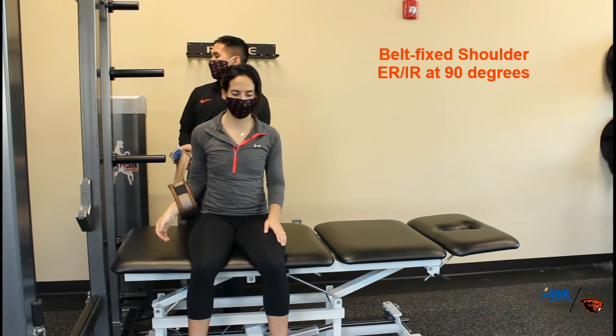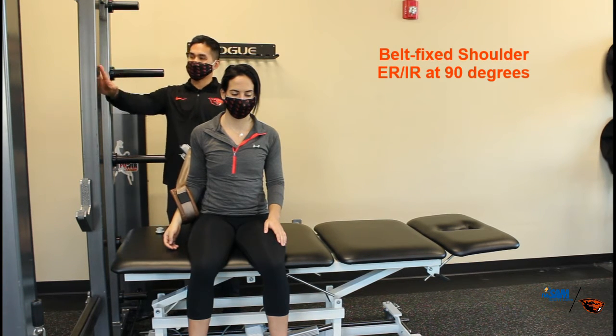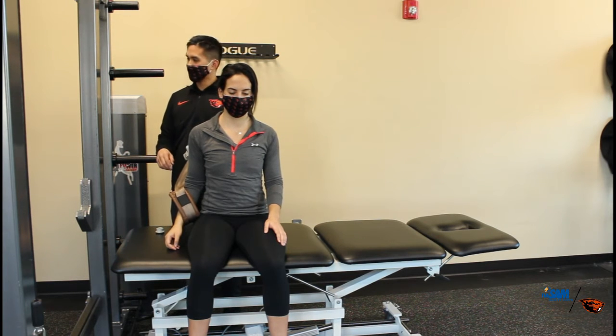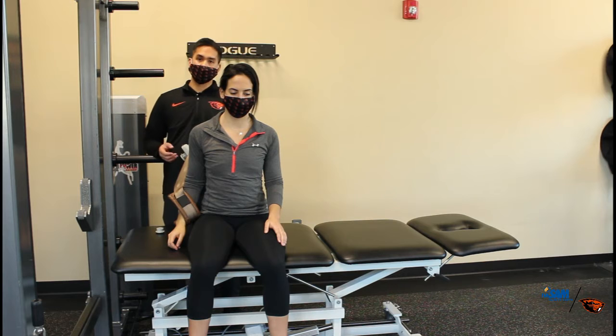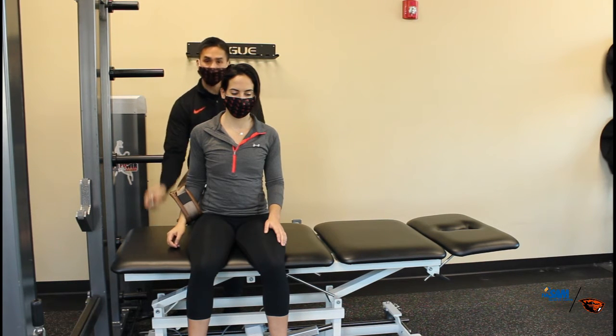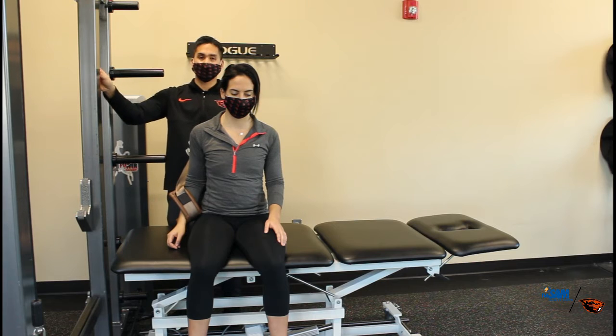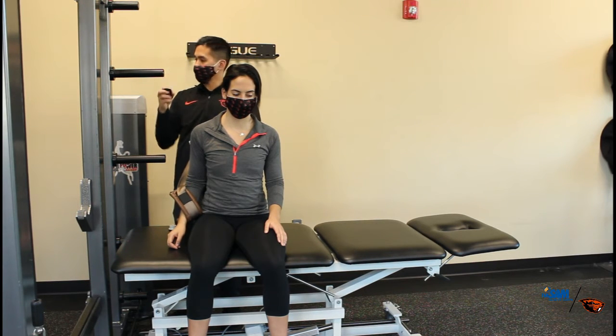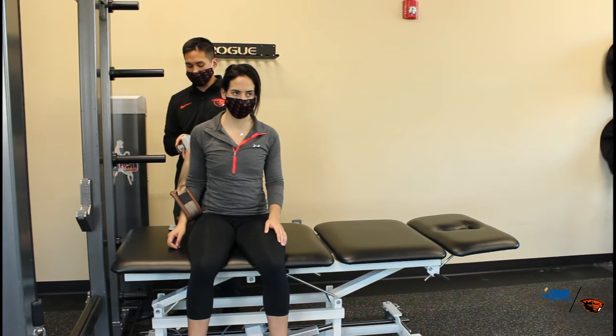All right, so for this one you can use any stabilization post for measuring 90-90 ER and higher in a seated position. We just have to have a convenient rack where it holds the plates. I actually switched the flat one out because we were using the flat one earlier for the zero position, and I put on a curved position just to match this. You're gonna have to do that based on whatever equipment you have too.